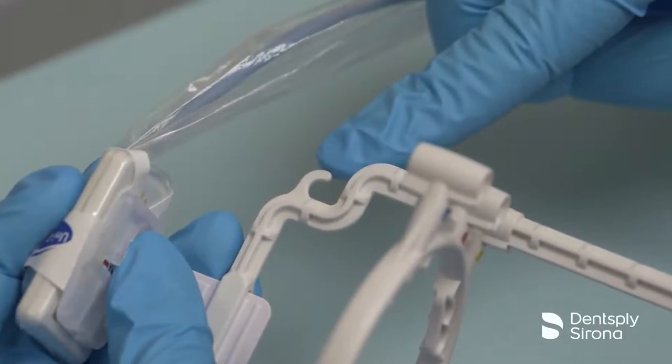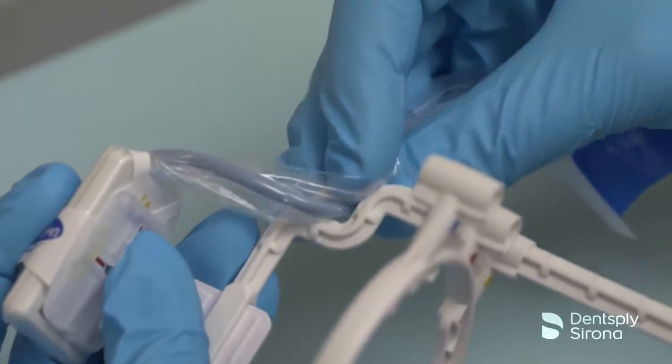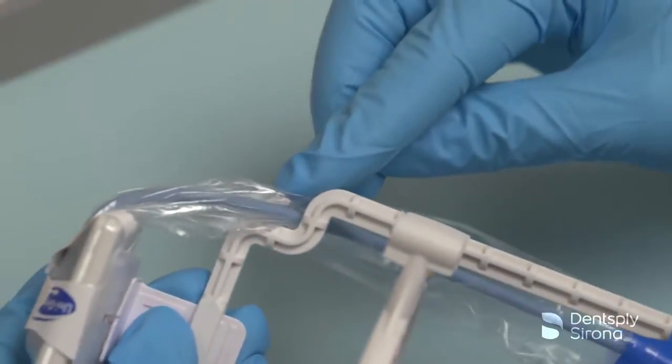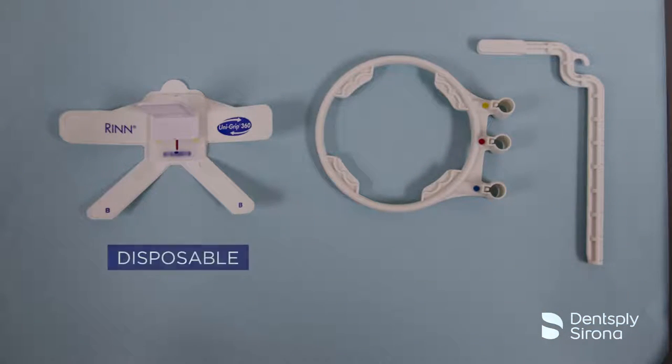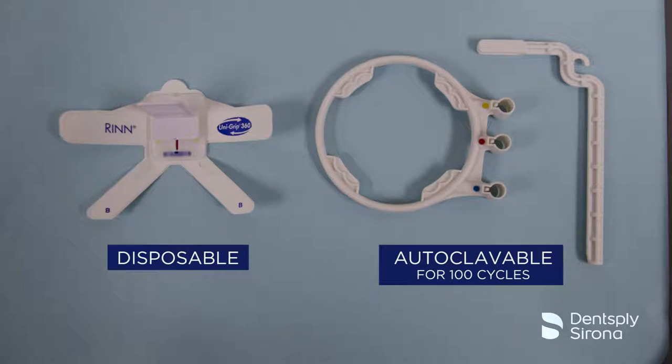The UniGrip arm and ring system offers a small hook feature to allow the clinician to rest the cord out of the way of the patient's bite and preventing cord drag. The UniGrip 360 Sensor Holders are disposable, but the UniGrip arm and ring system is autoclavable for up to 100 cycles.